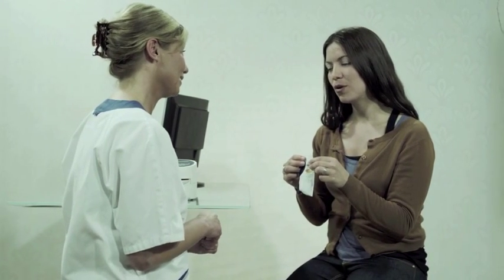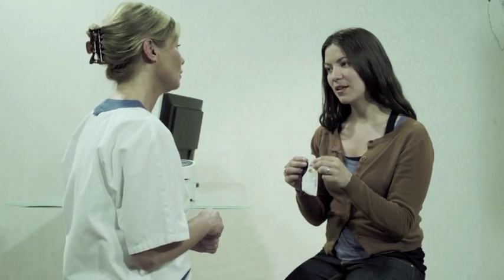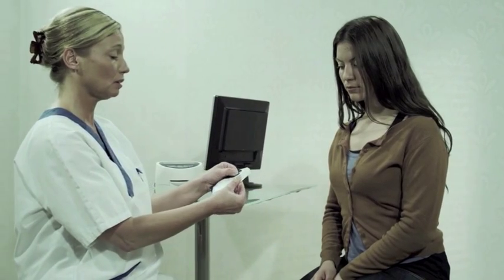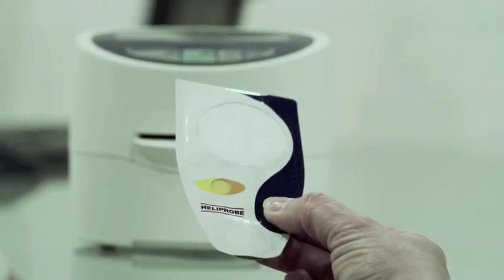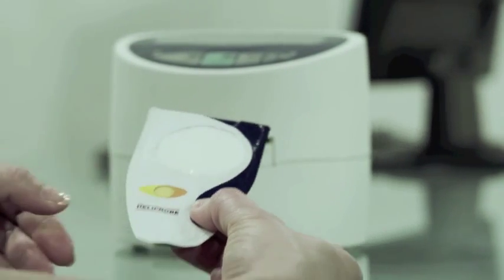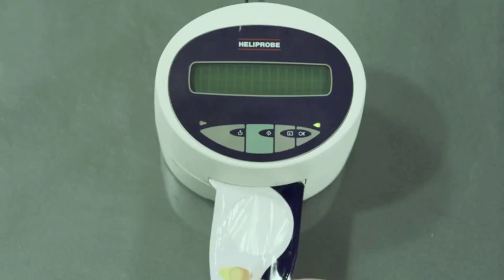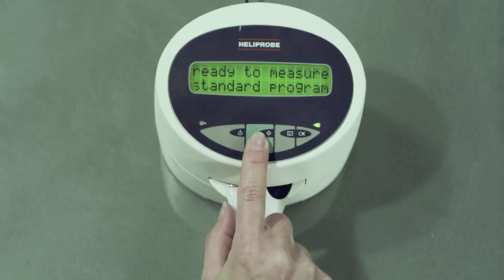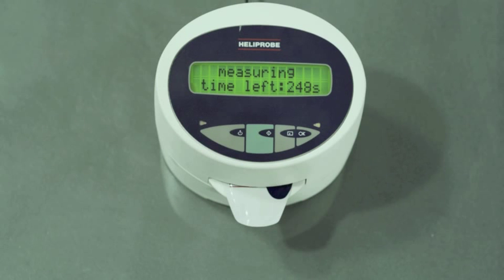Make sure the Heliprobe analyzer is ready for use. Gently press the air out without touching the transparent test zone, and make sure the transparent film is not broken. Hold the breath card by the mouthpiece and insert it into the breath card slot on the front of the Heliprobe analyzer.